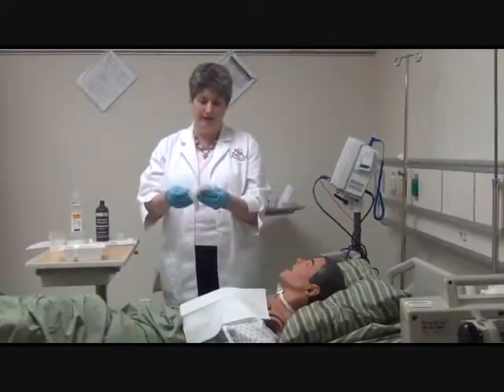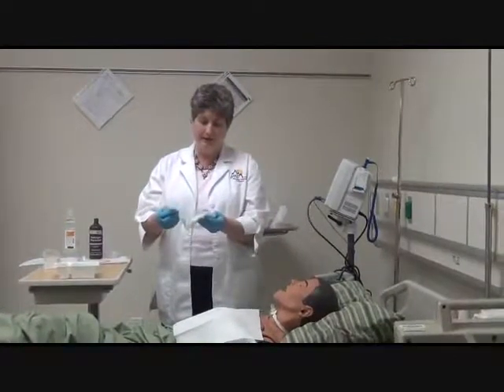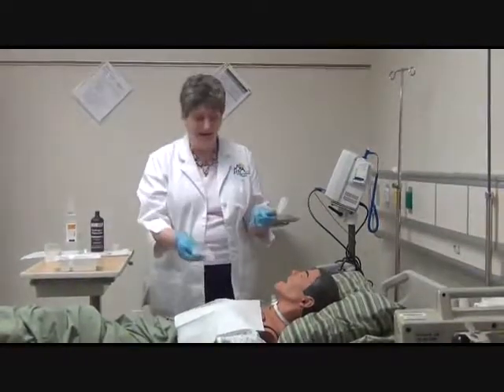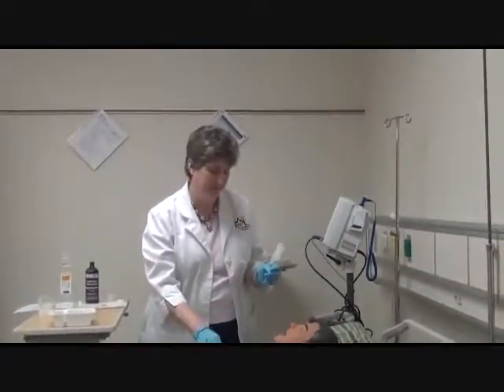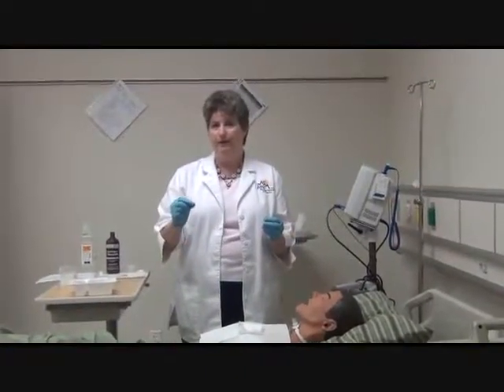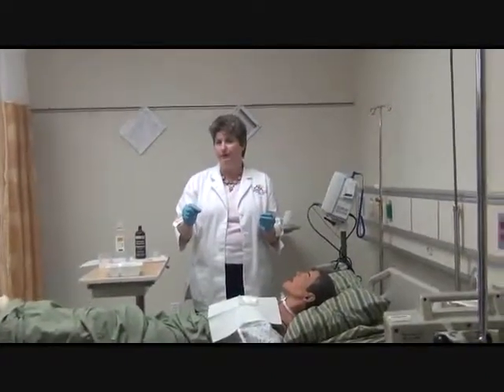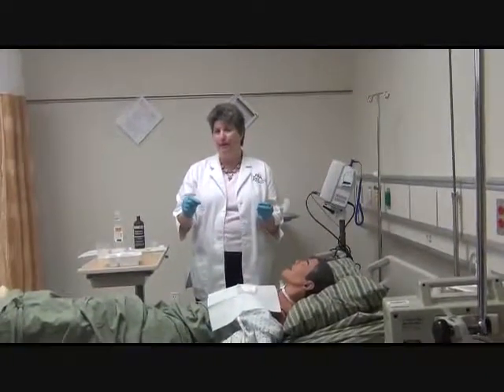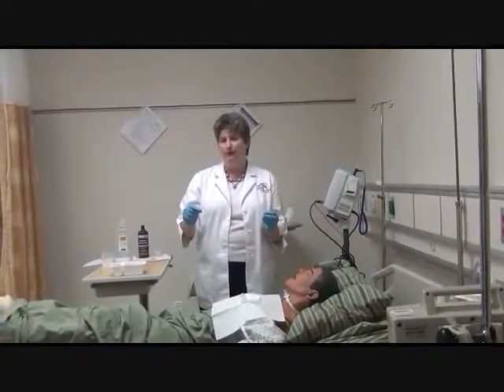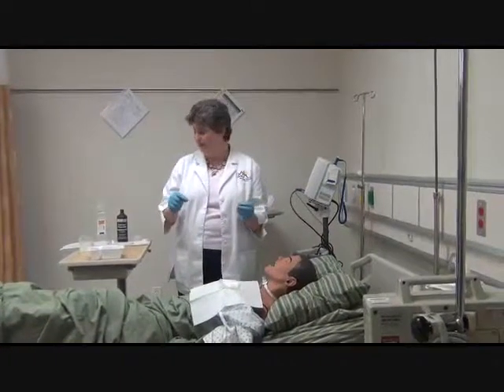I get my dressings out, and you're going to find that you have one dressing that has a split in it, and that is called a drain dressing. On the trachs, you'll find that those look as if they've been sewn, so you have no fraying edges that can get into the airway, whereas on a dressing like they use on a wound, those edges won't necessarily be as neatly finished off as your trach is going to be.